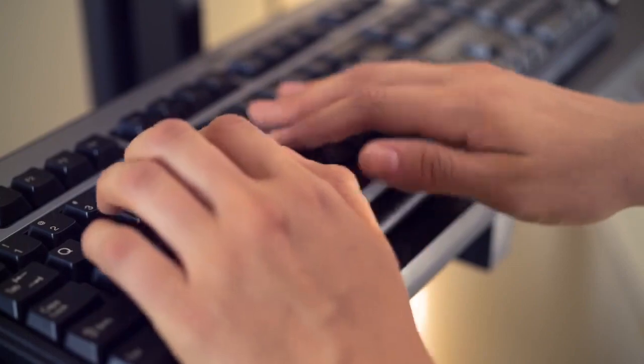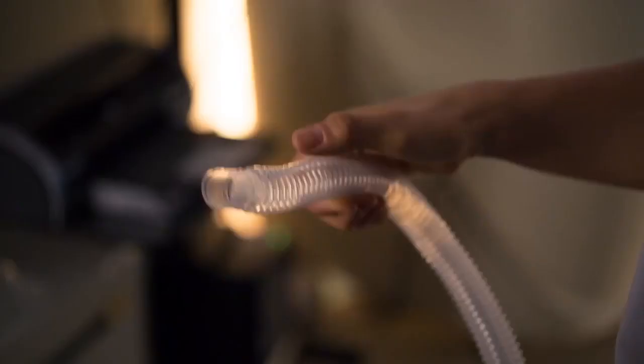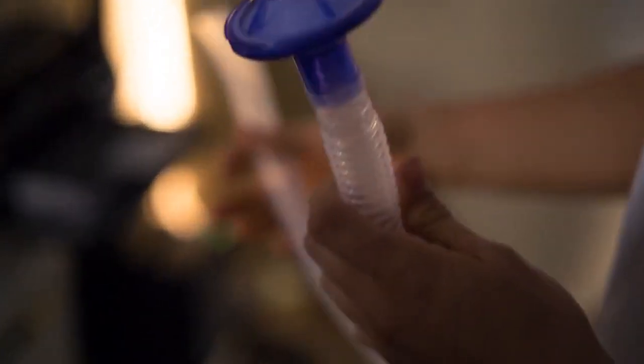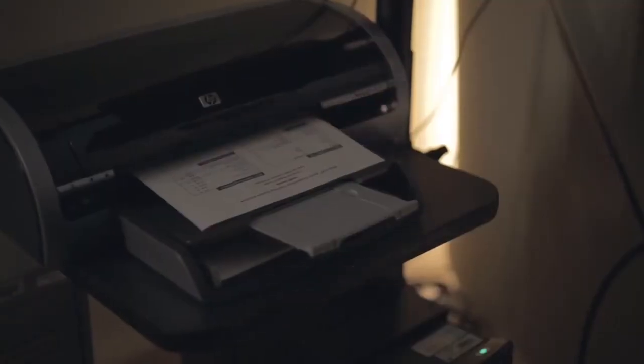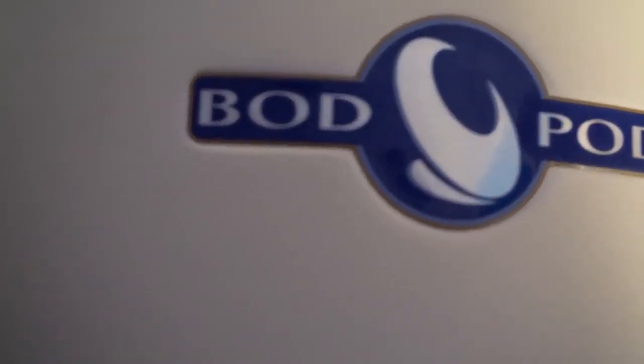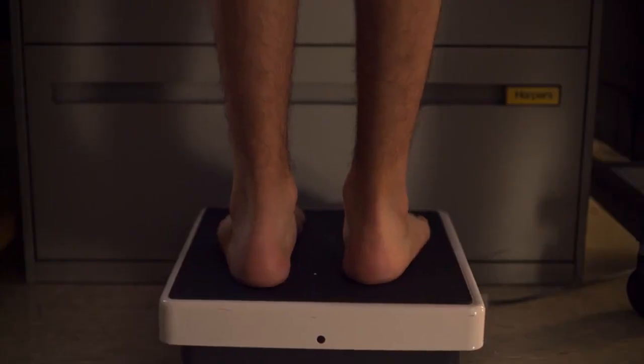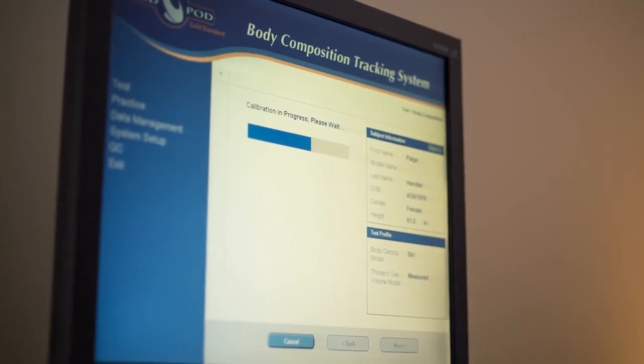The Bod Pod is basically the gold standard of body fat composition testing, and we use it to test the athletes here on campus as well as the regular population. The Bod Pod uses air displacement technology — it has two chambers which air passes back and forth. We also take the weight of the person being tested, and then it uses a density formula: mass over volume.